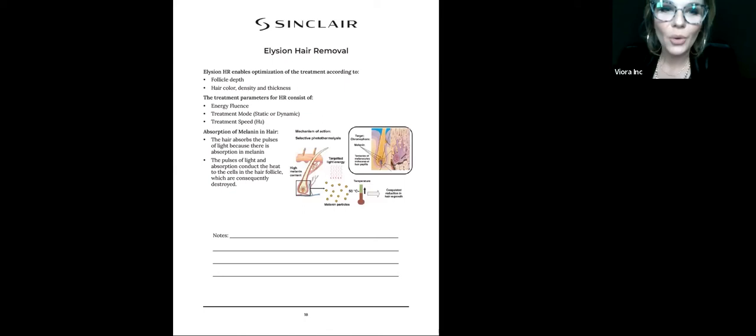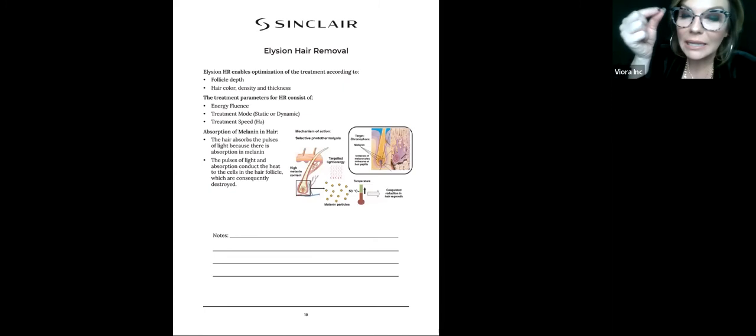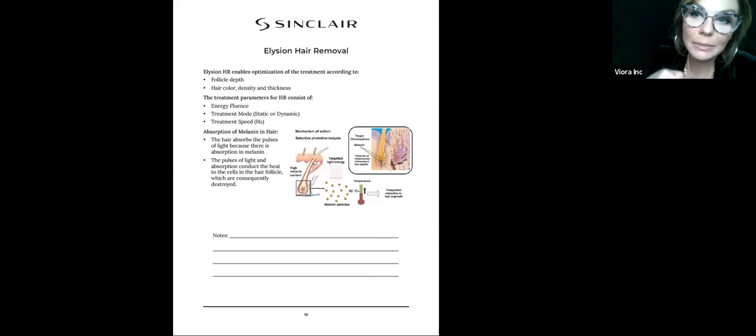So how are we killing this hair follicle? What are we doing? And it's, again, going back to that process of selective photothermolysis, light heat destruction of the hair follicle itself. So what happens is the laser is attracted to the pigment in the hair follicle. The heat then travels deep through the hair shaft to the bulb of the hair follicle. And that's when we build up enough heat that we get coagulation, and we're actually compromising the stem cells. So the stem cells are compromised and then can't produce the melanin or the hair in that area. So that's when we're getting hair removal.